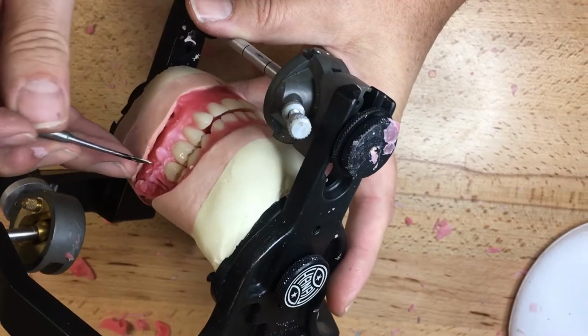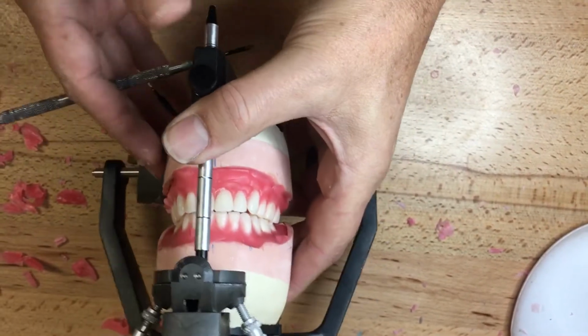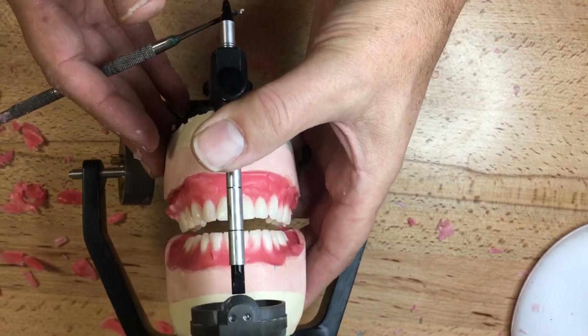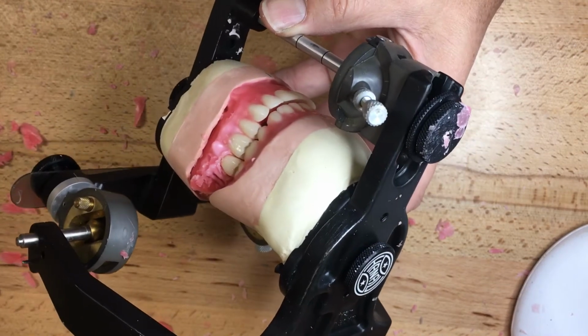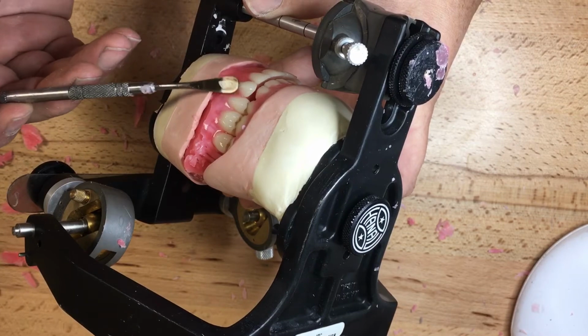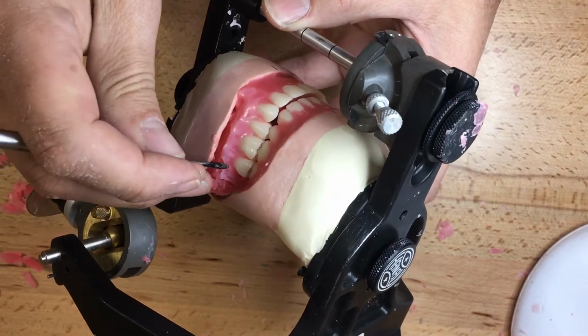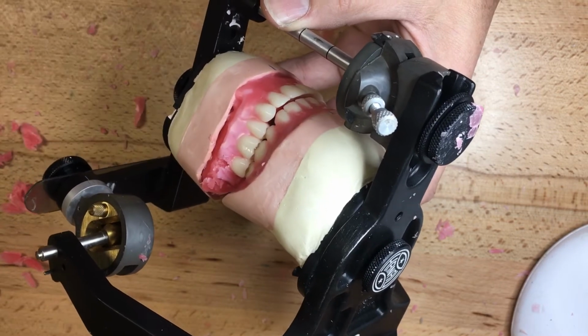I'm checking the overjet is consistent on all the teeth on both sides. The freeway space is consistent on both sides. Once I'm satisfied, I'm going to lute the teeth into the wax a little bit more solidified. This one seems to have fallen a bit. I'm going to push it up. There we go.